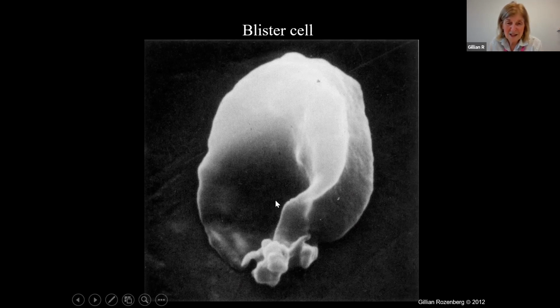It demonstrates that there's a space here where the Heinz body has been pitted out, where the content of the red cell also has been removed, so you've got a space, and then the red cell membrane has joined back up. You get a blister cell. And interestingly enough, you don't often see as many blister cells as you see bite cells on the blood film.